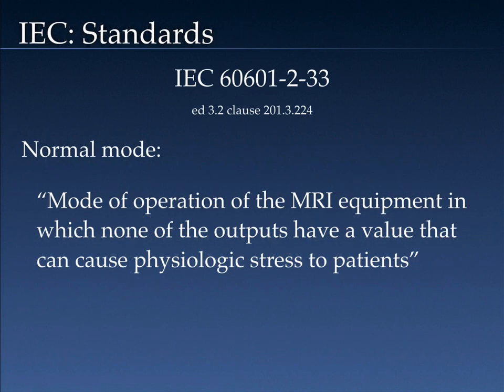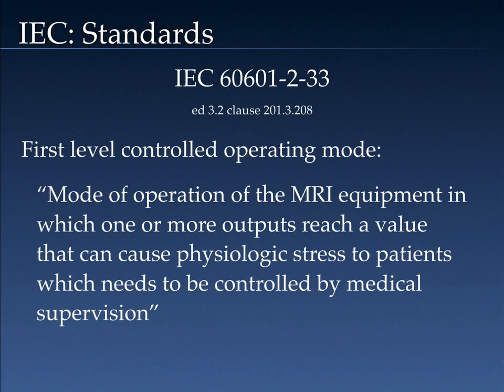The IEC provides standards for exposure to RF. The normal operating mode is the mode of operation of the MRI equipment in which none of the outputs have a value that can cause physiologic stress to the patient. First level controlled mode is defined as the mode of operation of the MRI equipment in which one or more of the outputs, and by this they mean either RF or the switched gradient fields, will reach a value that can cause physiologic stress to patients, which needs to be controlled by medical supervision.